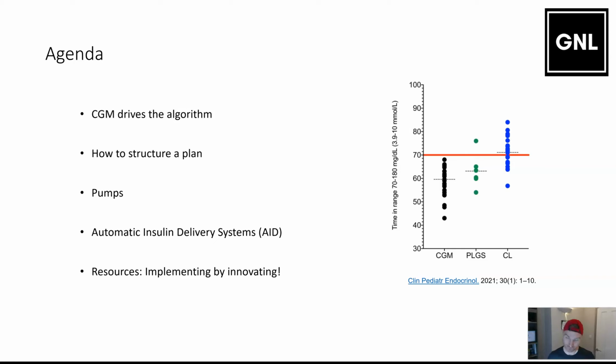However, during the day, if you do a lot of exercise, you may drop quickly. Stopping the insulin isn't going to work quick enough. You need extra carbohydrate or to pre-plan reducing the insulin before then. And similarly, if you go really high because you didn't eat a meal, obviously giving the insulin is not fast enough to manage that. So these systems are amazing, but they do have limitations, and exercise is one of the biggest challenges that these systems face.